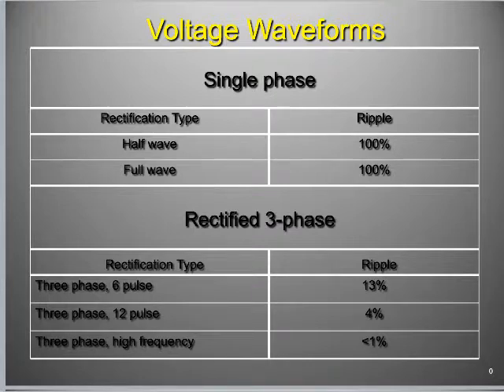Because as this one goes all the way up, as it starts to come down, the next one that was coming up starts to come up, and the next one starts to come up. So they even each other out across the top. So it significantly decreases the amount of ripple in the waveform. It gets rid of the low energy parts.